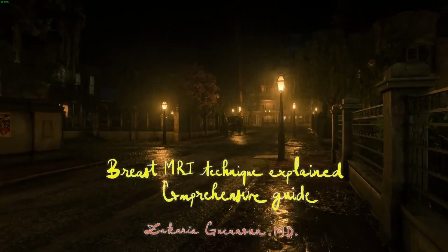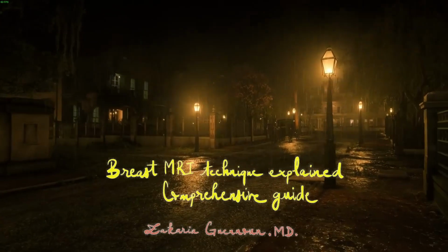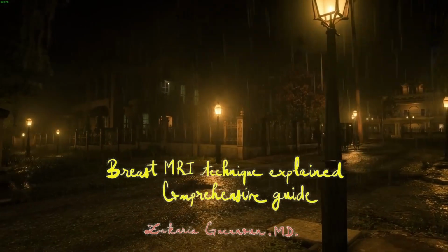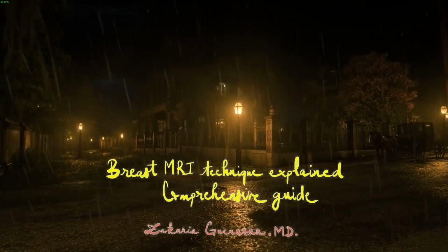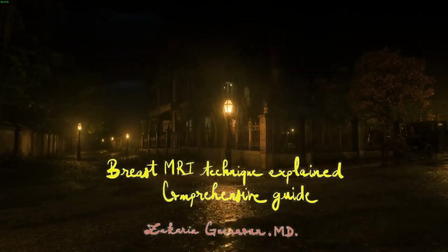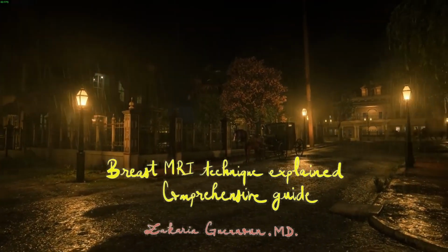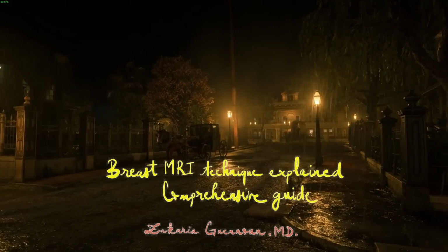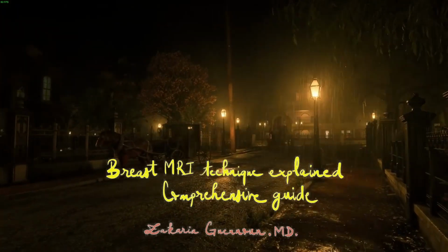And we have subtraction images, which are images processed by the machine, which will subtract the T1 weighted images fat saturated without contrast injection from the new T1 weighted images fat saturated with contrast injection. It will allow us to detect any gadolinium intake into a pathological lesion and discard the noise of the background parenchymal enhancement. The images, of course, have to be acquired in high resolution with slices less than 3 mm.